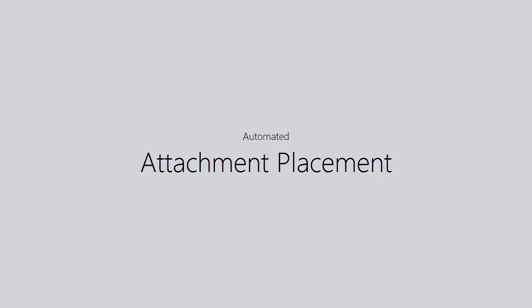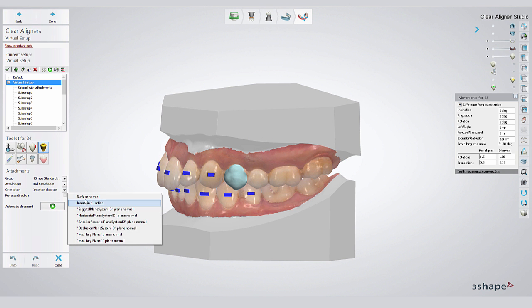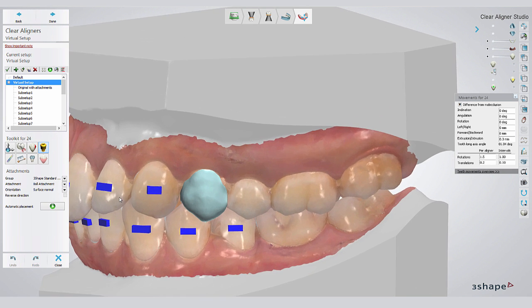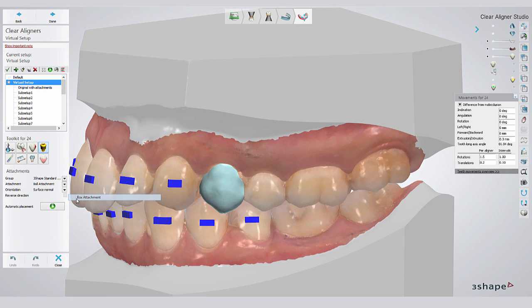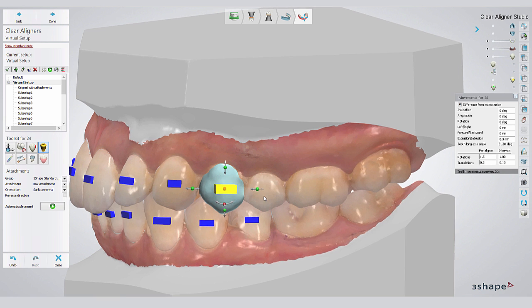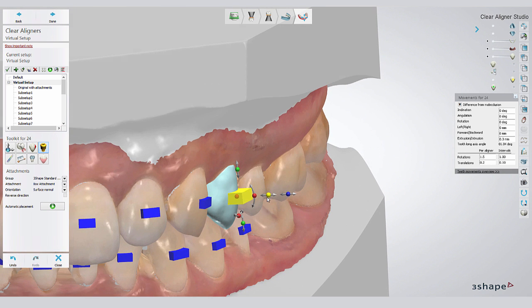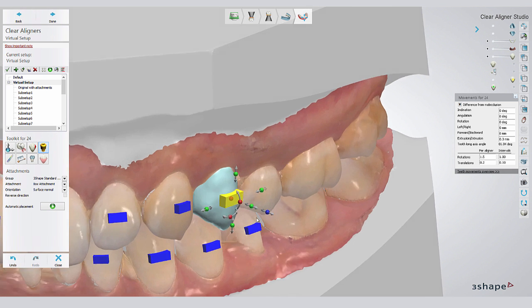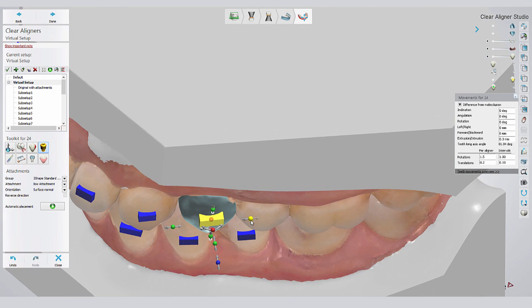So how does automated attachment placement work? If you select a tooth, the software will check whether the rules that you set up in the control panel apply for the movements that you performed on this tooth during your virtual setup, and it will suggest the selected type of attachment. You can still modify this attachment in its position if necessary.